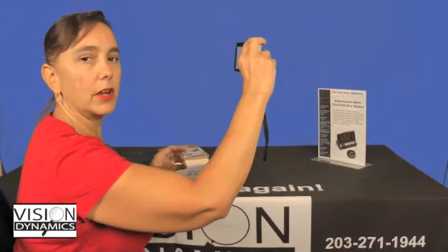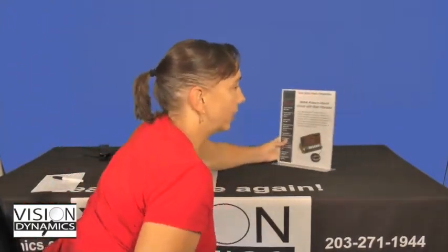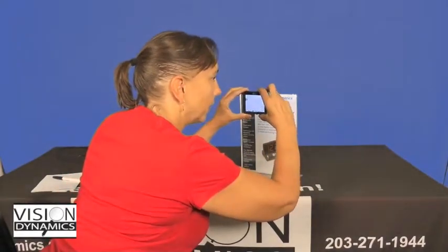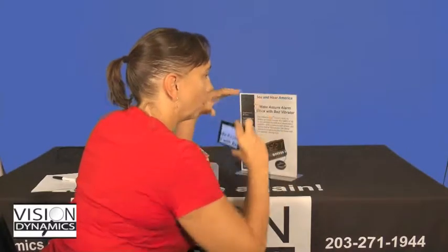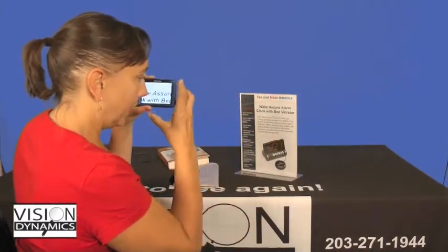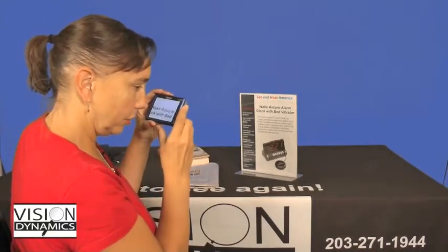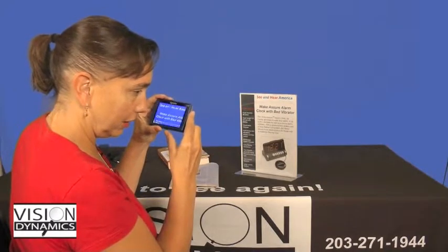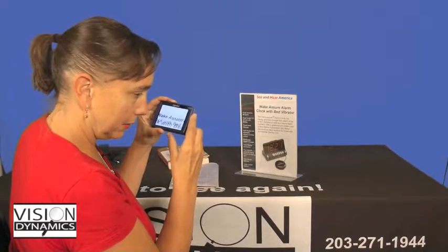And then, say I'm at the grocery store and I can't get quite close enough to that price list on the shelf. I'm just going to get this little sign over here for convenience sake, just to demo. I can take my Mini and I can capture what's on the sign or the price tag. There it is, captured, it's still on the screen, and I can make it larger or smaller. I can continue to change the color combination on it if I'd like, if that helps me see it better.